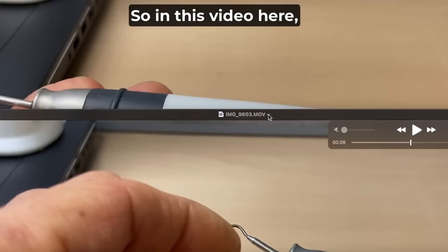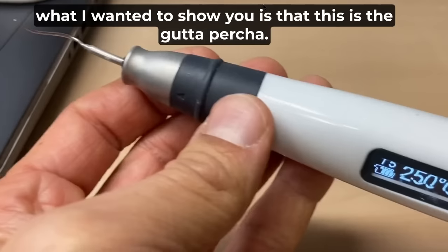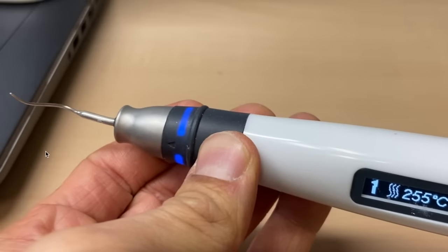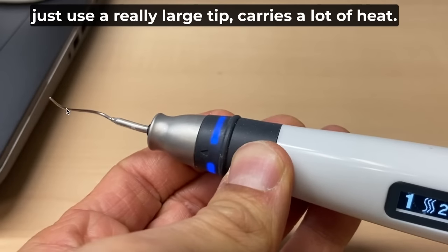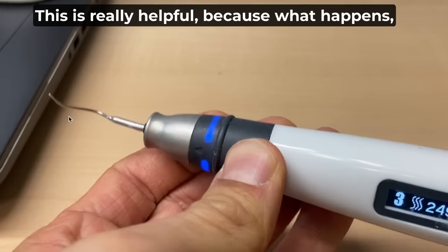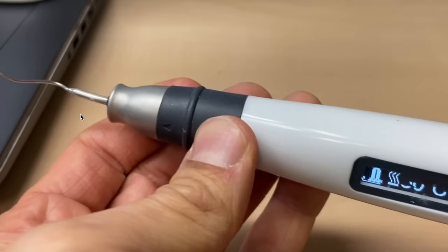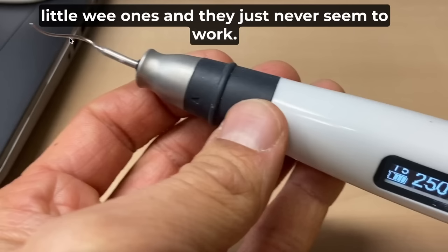In this video, gutta percha melts at 200 degrees Celsius, so I've set it for 255. See the thickness of this tip? A friend of mine, Reagan, taught me many years ago to just use a really large tip. It carries a lot of heat, and if we're only searing the orifice, you'll watch me. This is really helpful because in different dental clinics these tips burn out and get old, and then you're left with the skinny little ones, and they just never seem to work.